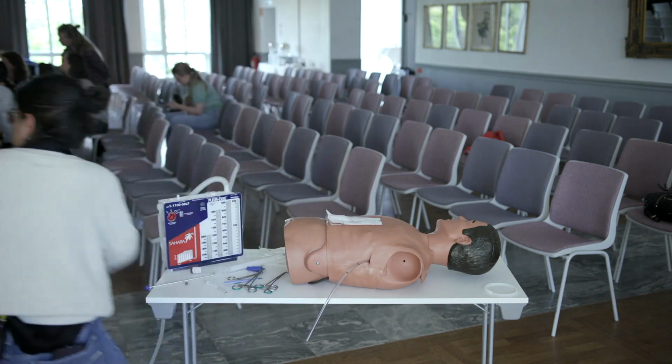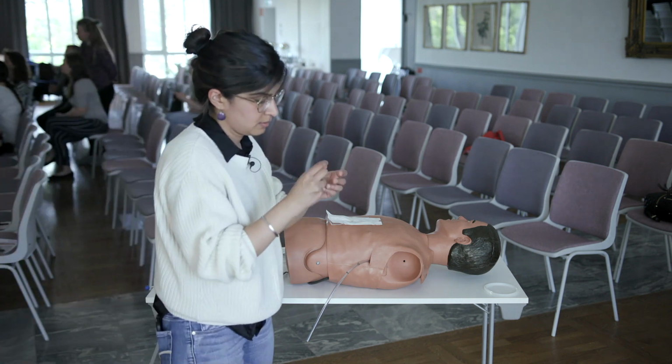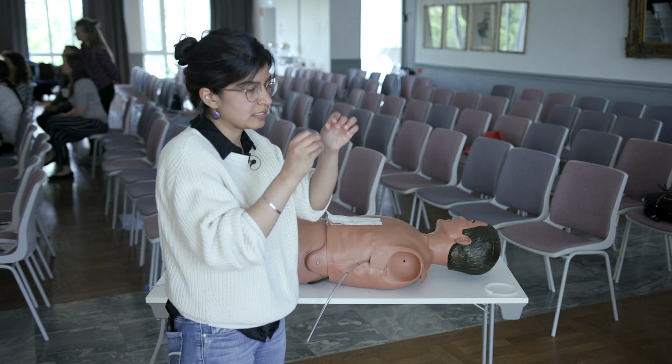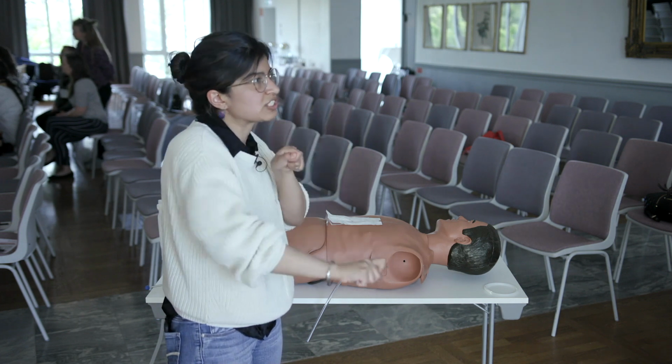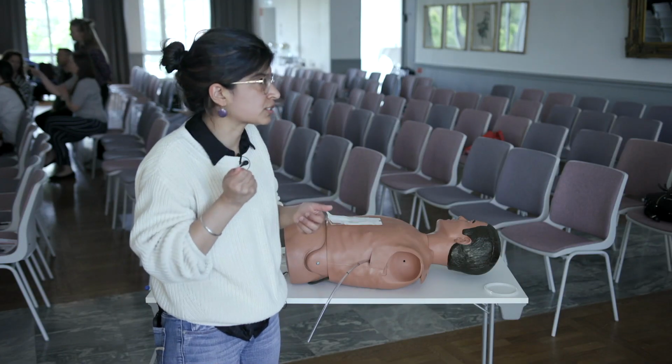So an air knot is over here. An air knot is essentially a loop that you don't cinch to the skin, right? There's a little gap between the knot and the skin, because you've all done central lines or other kinds of drains where the patient is really uncomfortable, right? And then you go look at the skin and the knot's pulling on the skin. That's the most uncomfortable part. So you never actually cinch it down to the skin. That's very painful, and it's constantly pulling on your skin.